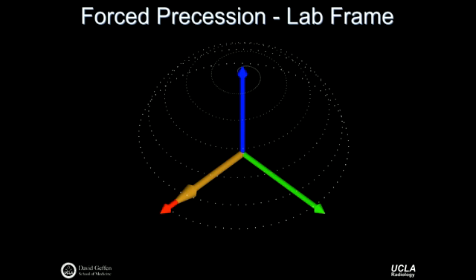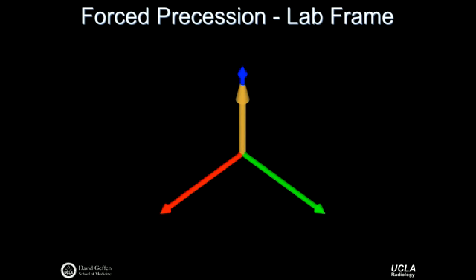So what determines its natural angle of precession? The equilibrium state is just here, right? So if you just put a bucket of water in the scanner, the bulk magnetization is just going to point along Z, and it's just sort of like, you can't quite see it, right? Because it's just precessing along its own axis, right? It's not until it's off axis that this wobbling behavior becomes apparent, right? And then when it's way off axis, then you can totally see it.